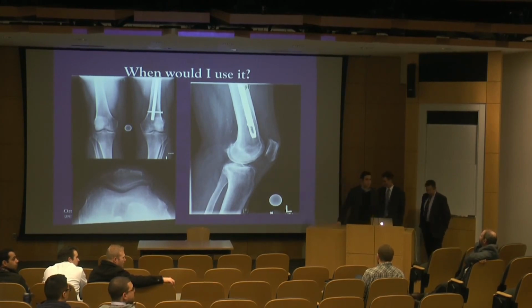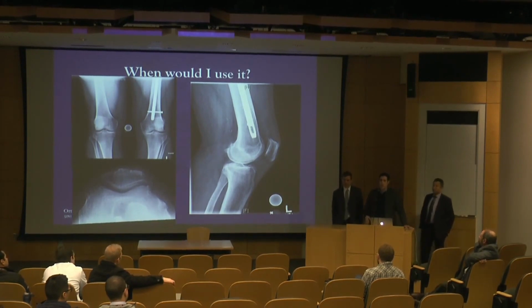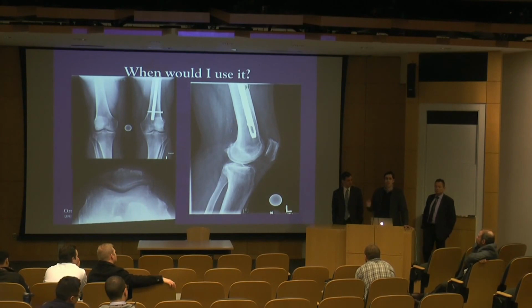Yes. So I think that's a very important point. We like to think about total knee arthroplasty as a bony operation, but it's also very much a soft tissue operation, just like total shoulder arthroplasty. But I think it's important to keep in mind that there are two separate questions. You want the components to be in alignment that's neutral relative to a mechanical axis of weight bearing.